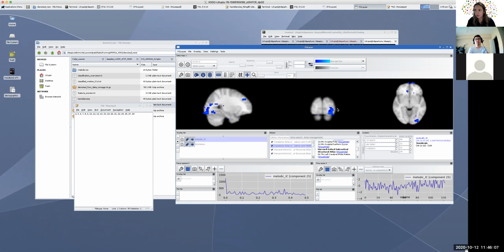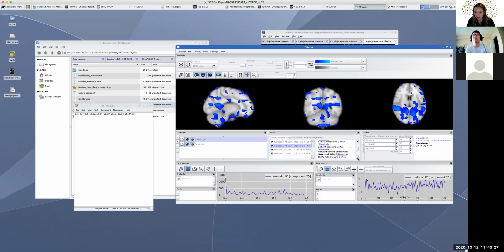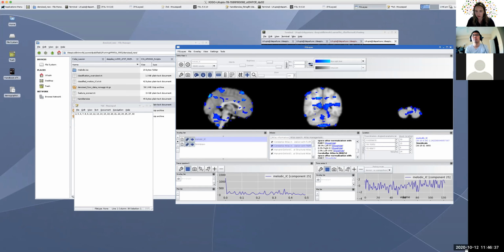And I've also had some where it was completely blank. So you could try to go down a little bit just to see where it is. But if it's completely blank, there's no component visually observable, then I would probably put that as noise just because it doesn't really add anything. Okay, but in here I can kind of see what's going on. This is pretty messy.